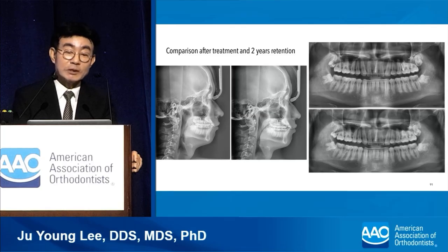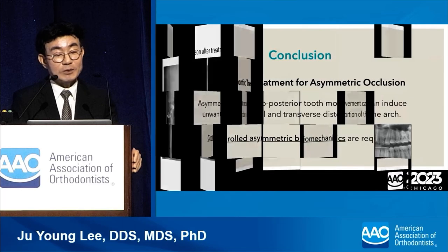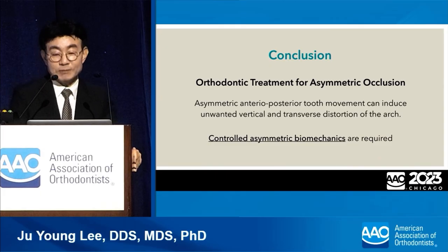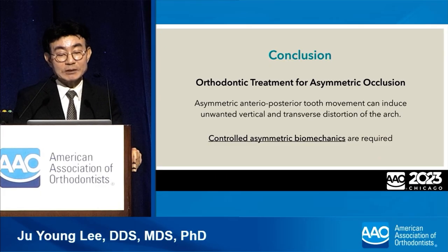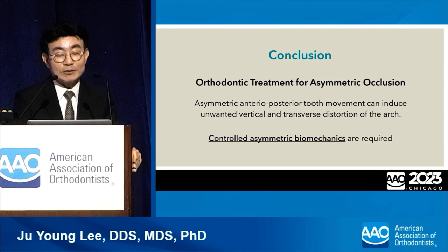TAD-supported pushing force can be effectively used in cases where an asymmetrical occlusion must be intentionally formed due to unilateral tooth extraction. Let's summarize today's lecture. To improve asymmetrical occlusion, if we move the patient's teeth anteriorly or posteriorly differently on the left and right sides, unwanted vertical and transverse tooth movement may appear. So, controlled asymmetric biomechanics are required.